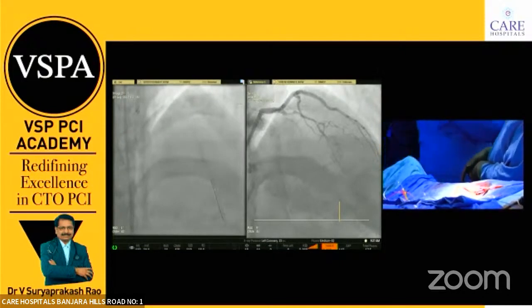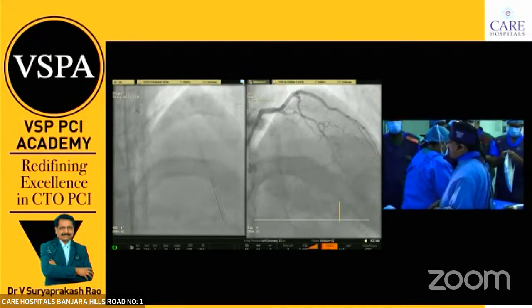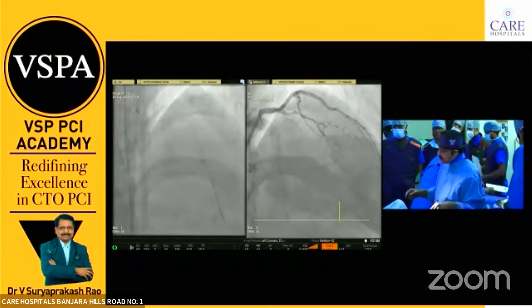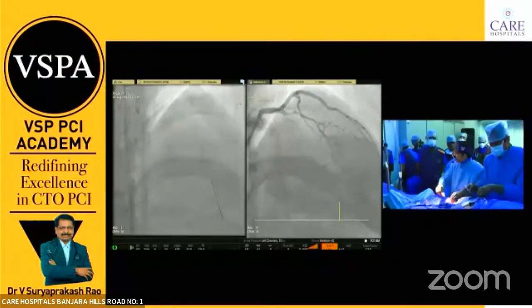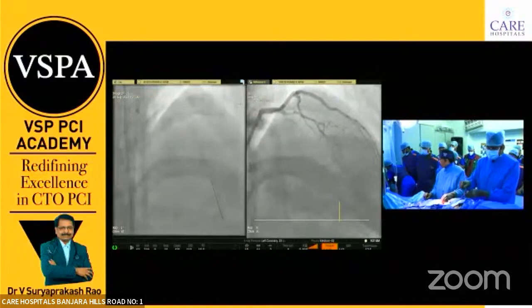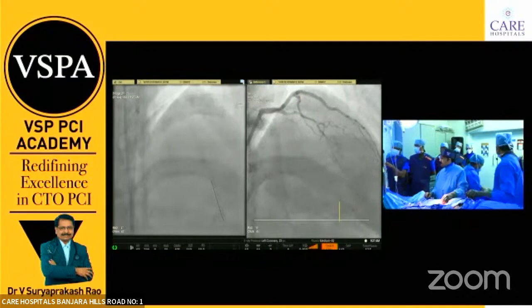We are using here the Boston Scientific 60 megahertz. Mr. Ravi, who is an expert in IVUS interpretation, technically helps us in most of the cases. You can watch the steps. Somebody can focus the camera on how the IVUS is arranged.